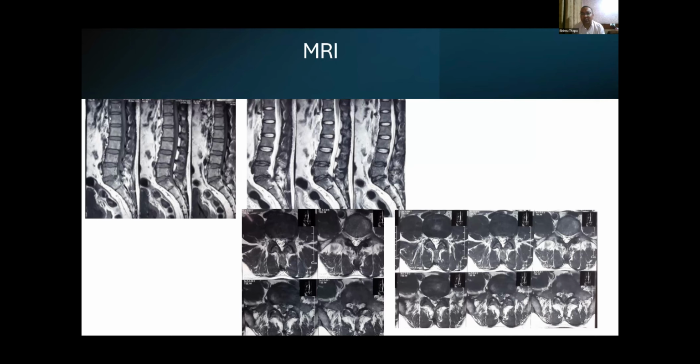I've gone through the literature as well, on whether cauda equina syndrome is treated by endoscopic or not. I found there are many articles, a case series and comparative studies also. So that's why I chose the endoscopic technique in this case.